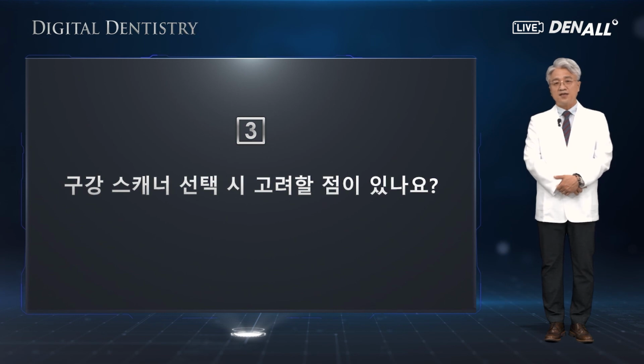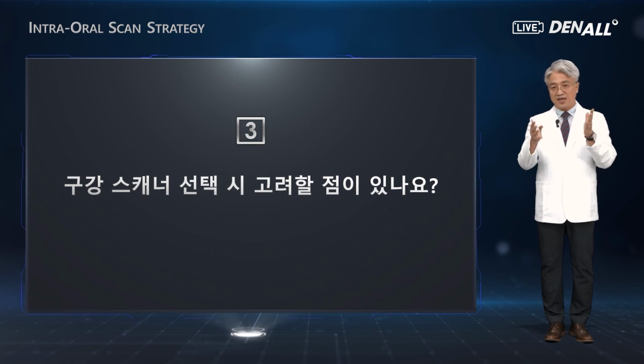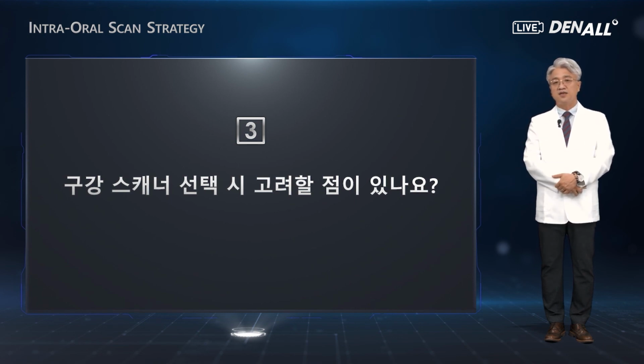Video type precise scanners were not available that much, but many companies upgraded the scanners and video type scanners are available, many of them. And the price range is quite broad, so fitting to your dental office, appropriate price and appropriate performance scanners can be chosen.